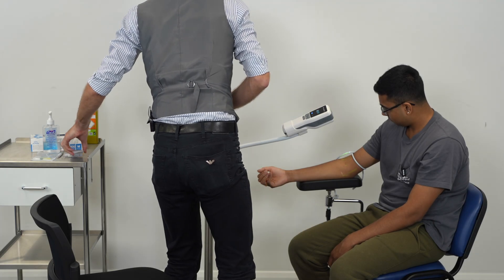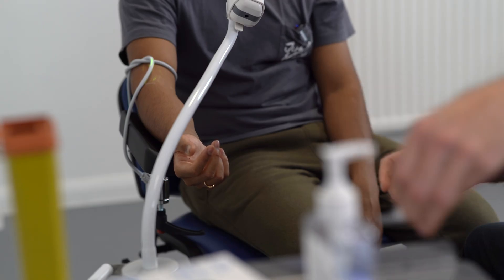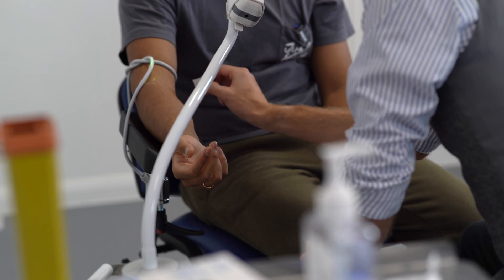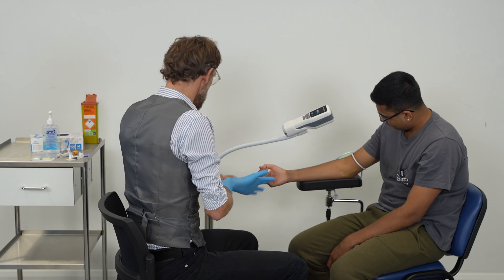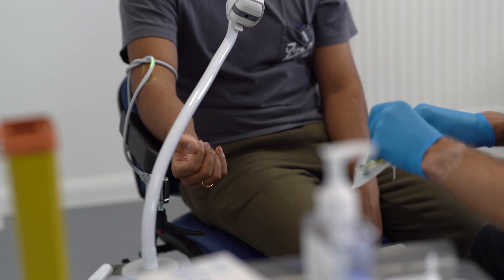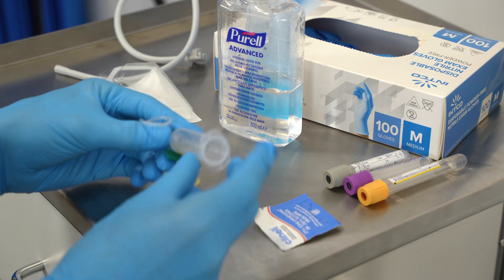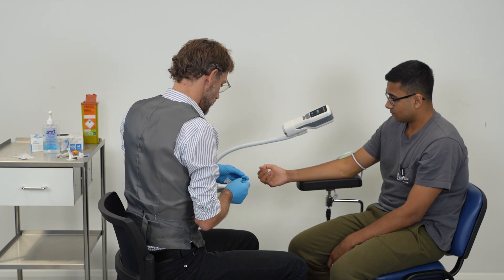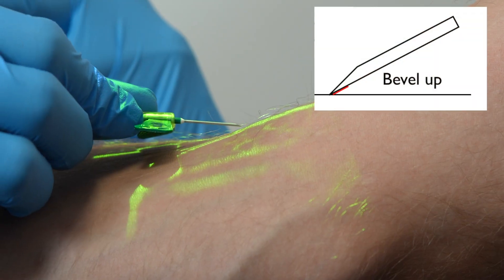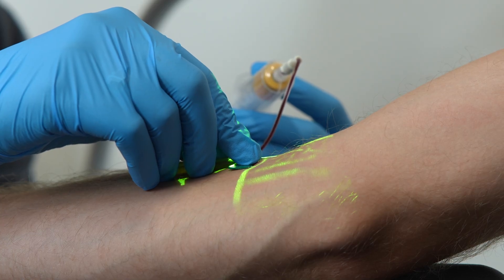Yeah. And we're just going to get the chlorhexidine wipe, going straight down there. We can see very nicely. We're going to target it, and we're going to get one of the tiny blood vessel kits so you're even less likely to feel it. And we're going to attach it onto the vacutainer. Pulling the top off — so we've got a live needle. We're going to get the yellow vial and come in nice and close, go into there, and put the vacuette in at the same time. So we've got the vacutainer for the blood.